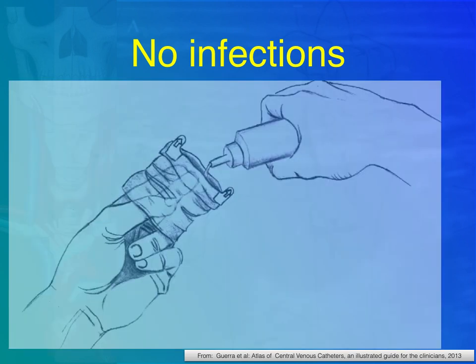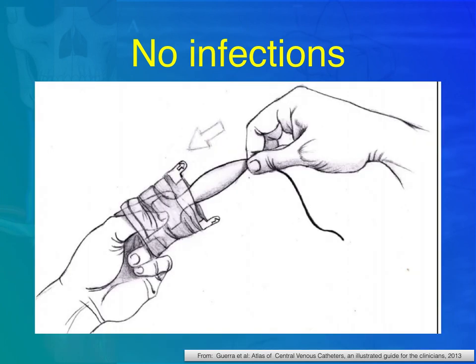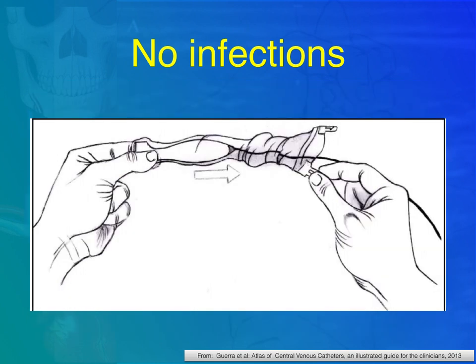No infections. Sterile, single-use only ultrasonographic gel should be used all the time when prepping a patient. Here we see how the probe cover is being filled with sterile gel before placing the probe. Once the sterile gel has been placed inside the probe cover, a non-sterile helper will place the probe in the cover. The cover has small pulls that can be used to slide the probe cover over the wire of the probe. Very important, look how this is illustrated.